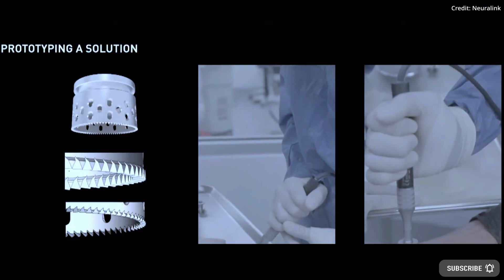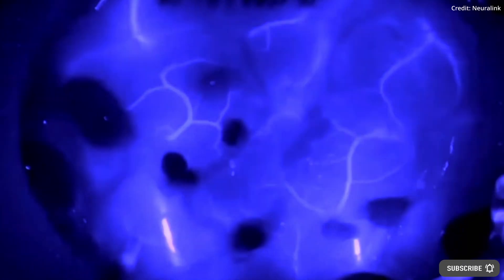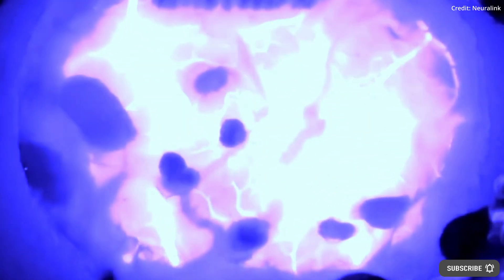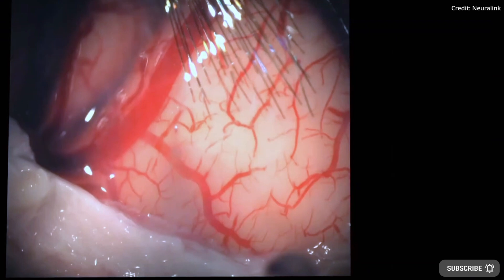In terms of applications, since 2021, Neuralink has been improving the speed and accuracy of the cursor to eliminate lag with great success thanks to the help of artificial intelligence.